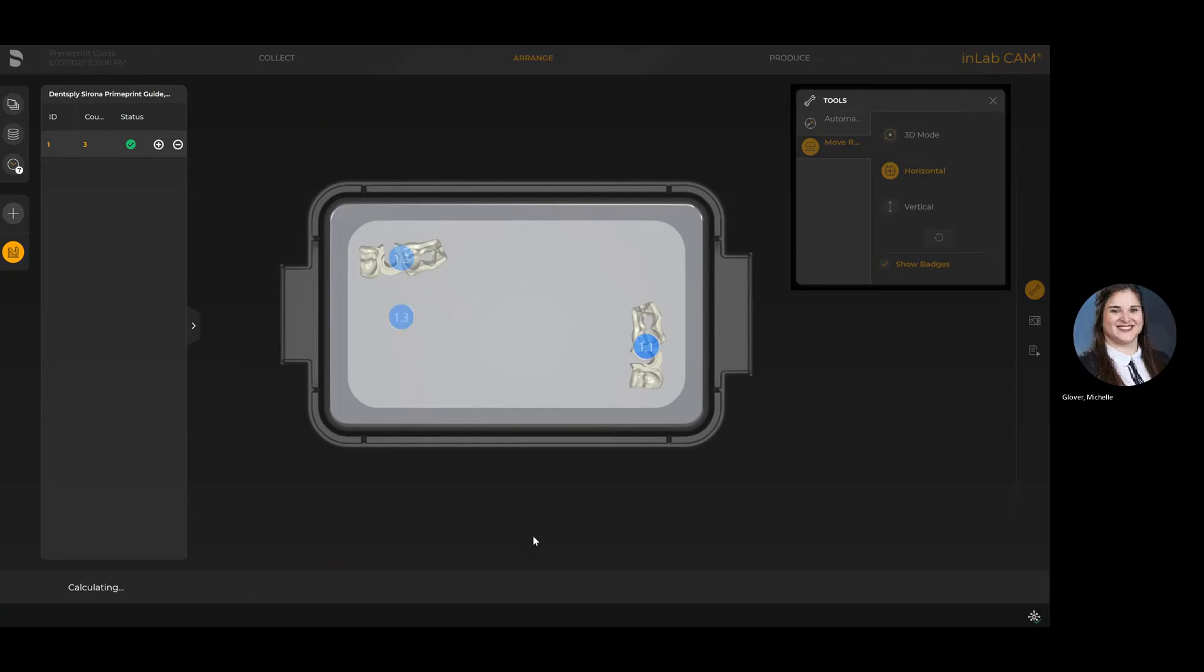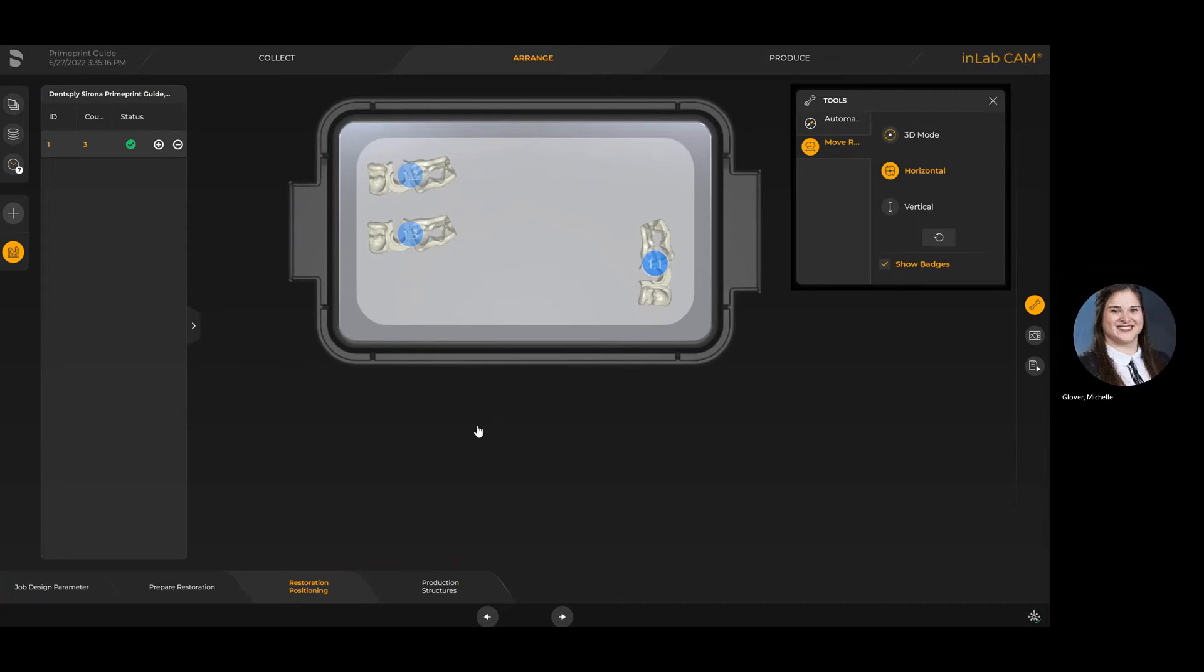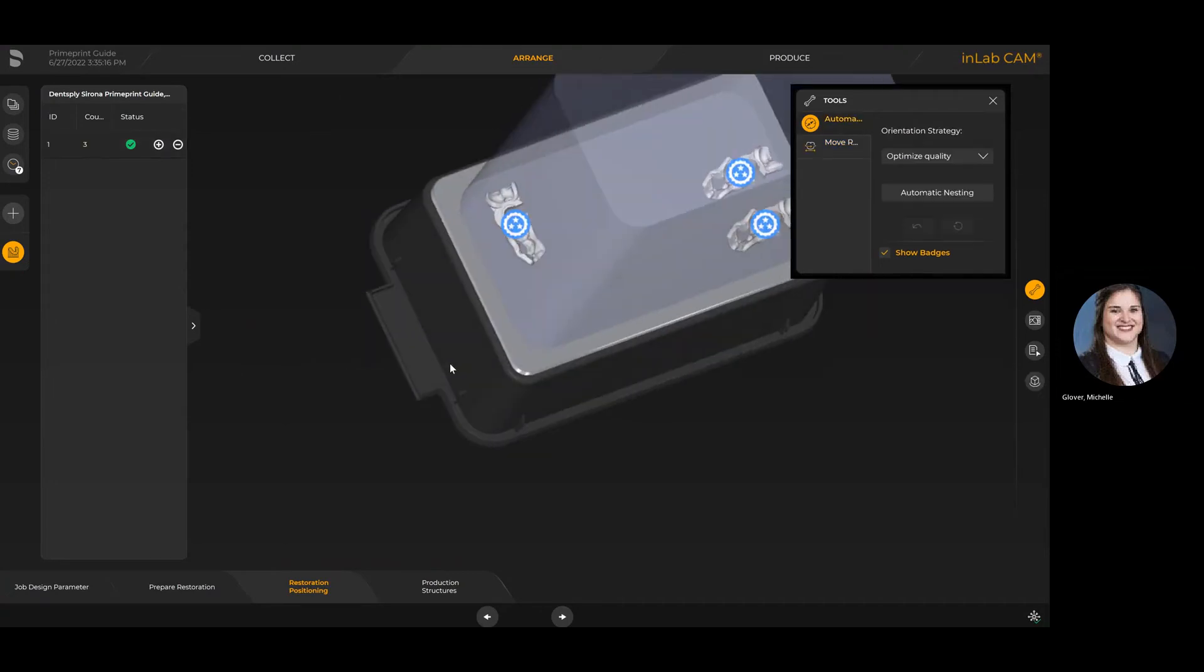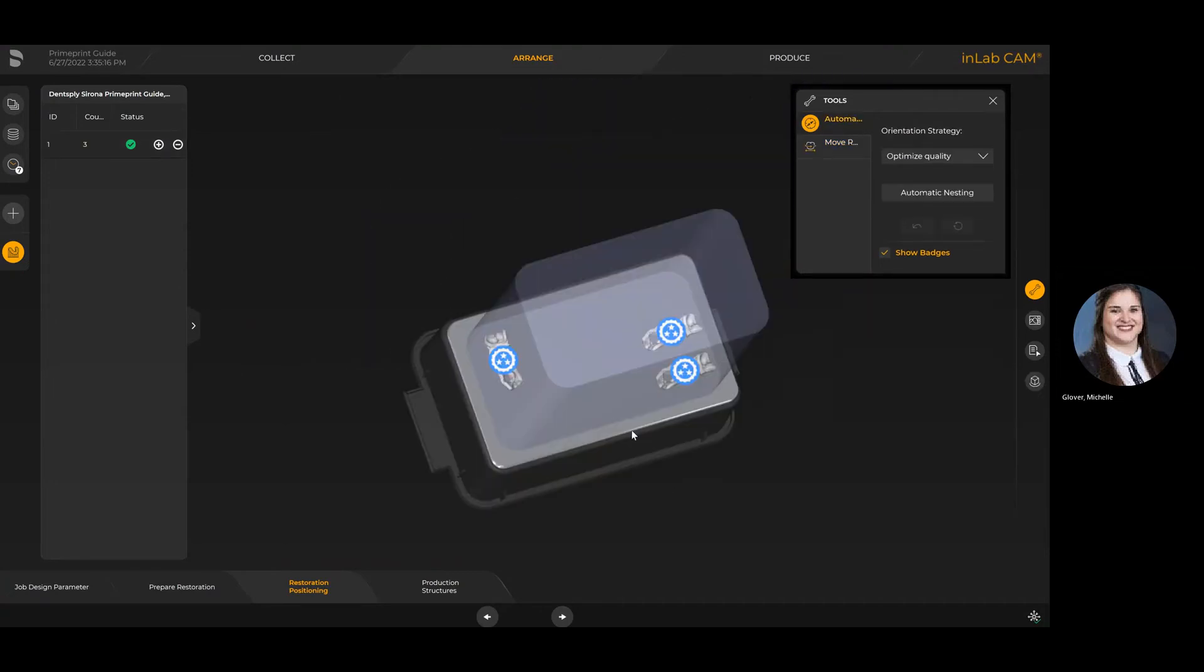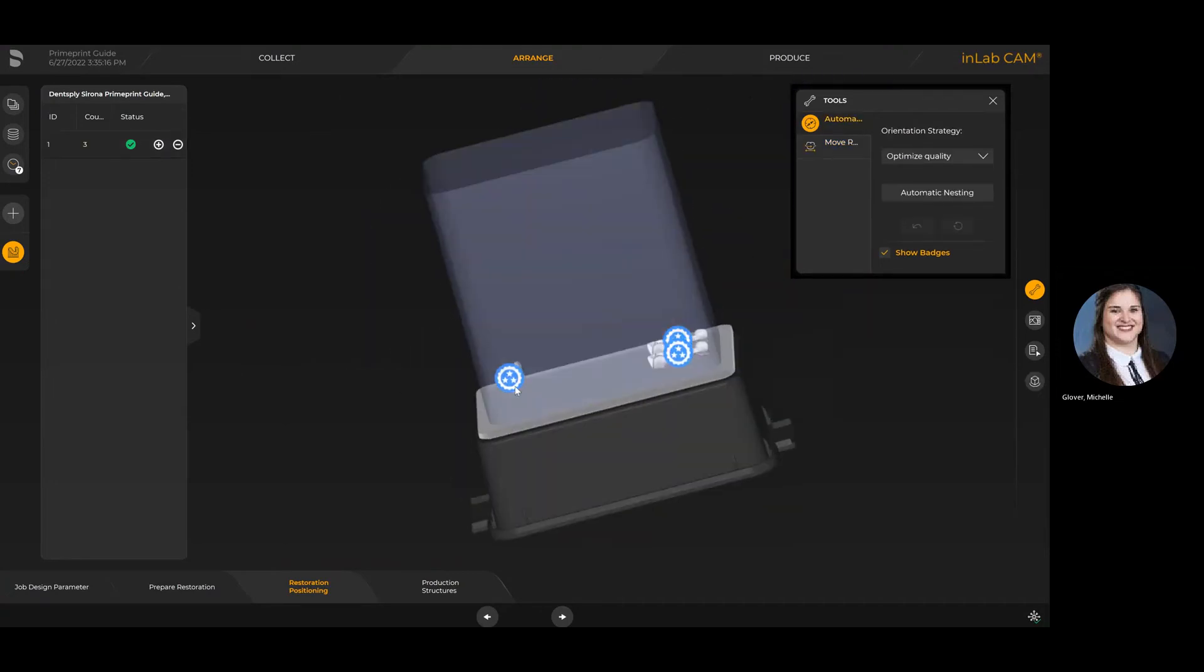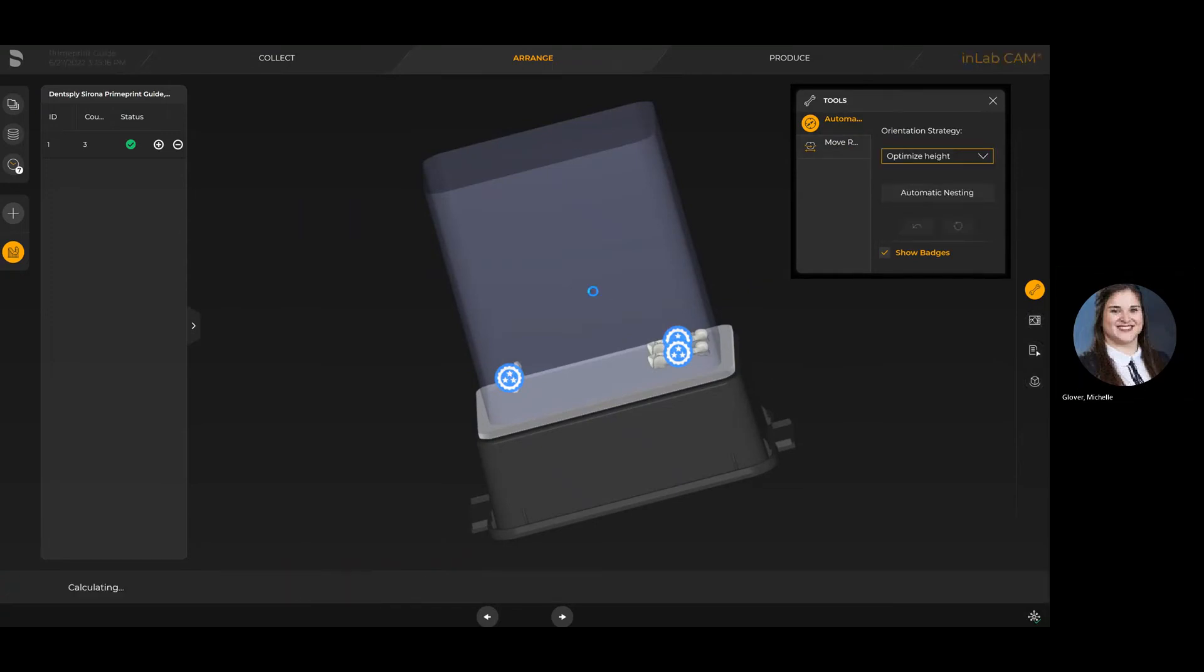What's really nice about InLab CAM 22 is it does save you a lot of working time. Other CAM softwares when it comes to printing still require a little bit more manual manipulation. However, with InLab CAM, it's very intuitive and user-friendly to do a lot of this work for you.